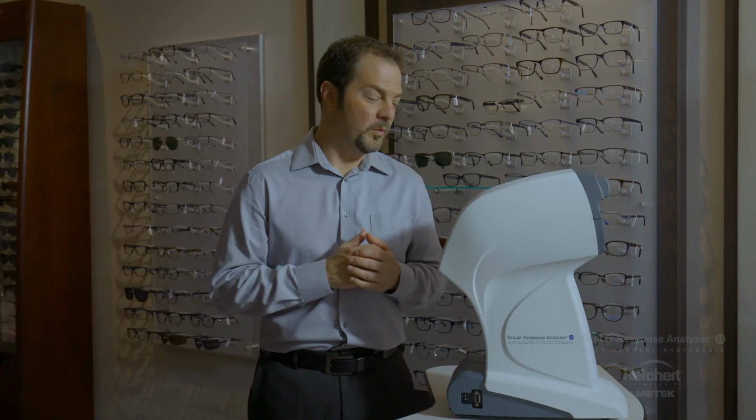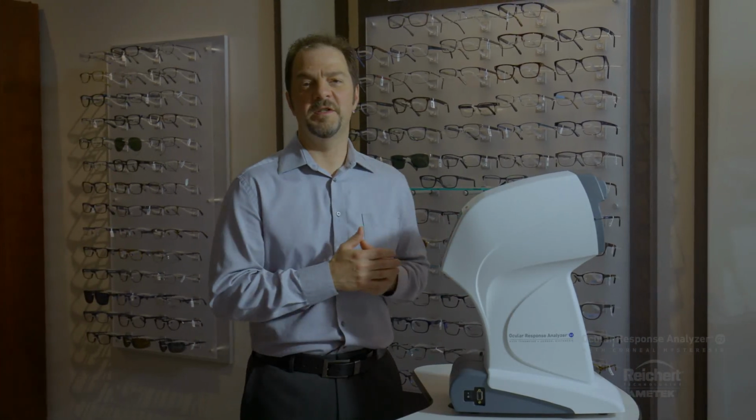Another frequent question we get is related to asymmetry between the two eyes, particularly with the IOP measurements. Some people will say, well, I always get the same value in the two eyes on my patient with a Goldmann tonometer, and with this device sometimes I get 2 millimeters of difference, 4 millimeters, 5 millimeters of difference between the two eyes. Why is that? The answer is twofold.